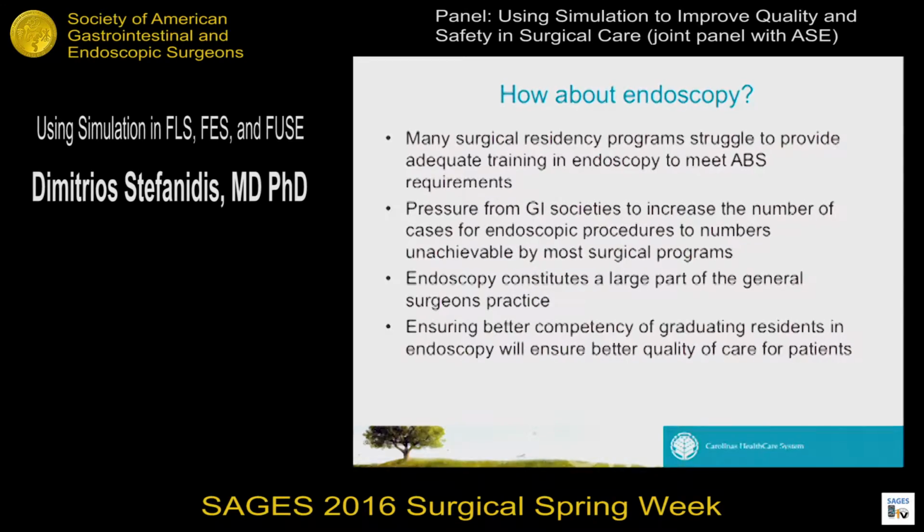There's also, if you're following the literature, a few years ago, GI societies put out a statement saying essentially that you have to do a large number of endoscopy cases to be considered good, which is actually beyond what most surgical programs can offer.